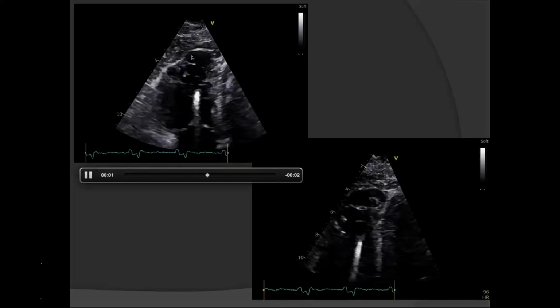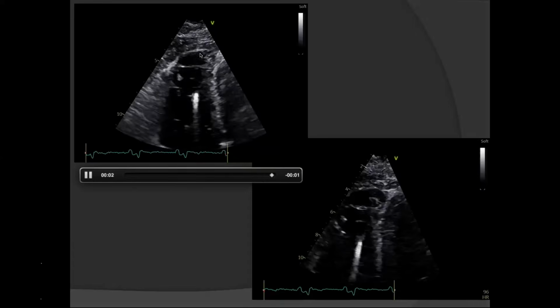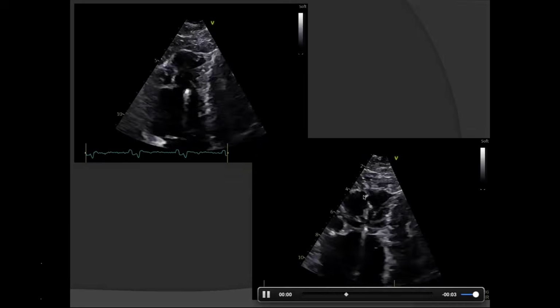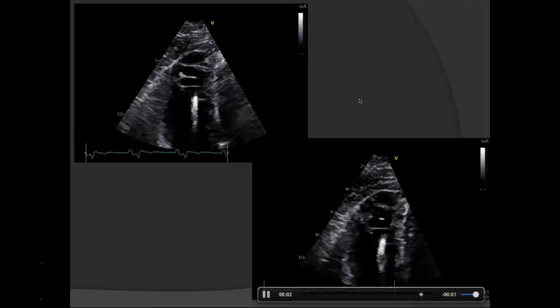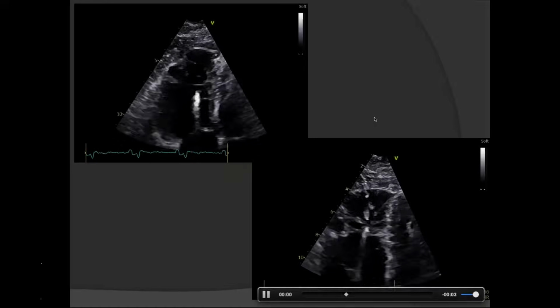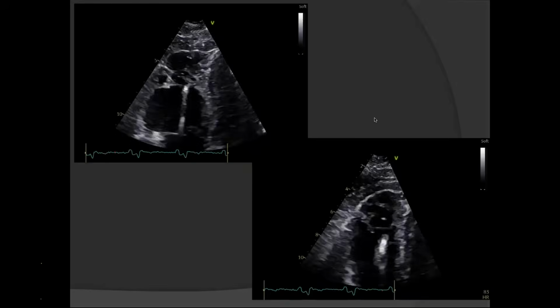Further zooming of the image, you can see microaneurysm formation, bulging out of a small part of the RV wall, clearly demonstrated here in this apical view. Again, this view clearly shows bulging out of a small part of the RV happening. So unless you are suspecting this and looking at different parts of the RV by zooming the image one by one, so that all parts of the RV are included, you will not be able to pick out these abnormalities.